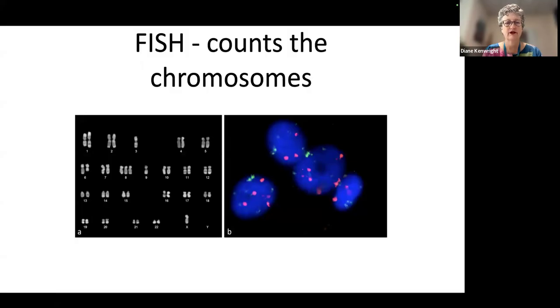Let's think about the principles of FISH before we move on. The principles of FISH are that there is a tumor karyotype, and we can detect specific aspects of that karyotype by fluorescently labeling certain chromosomes, which we do here. So here we have 4 blobs of red. This will be a comparison chromosome marker.